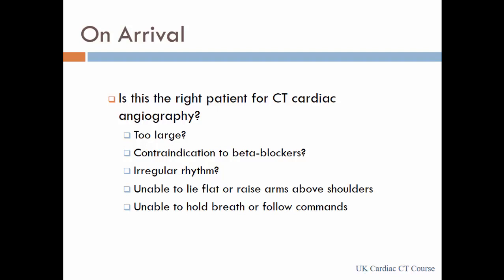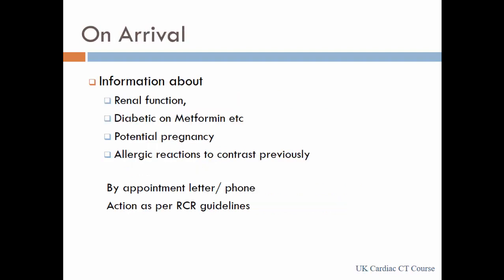The biggest problem is patients who are not able to lie flat on the scanner table and are not able to put the arms up, because they have to raise the arms up. If the arms are down by the side of the heart, then you will get lots of artifact from the bone here, so the scan will be non-diagnostic. Lastly, that will probably become an absolute contraindication if they're not able to hold their breath. Breath holding is required for about 10 seconds during the scan. If they can't hold their breath for 10 seconds for any reason, then they would not be able to go through the scan properly.